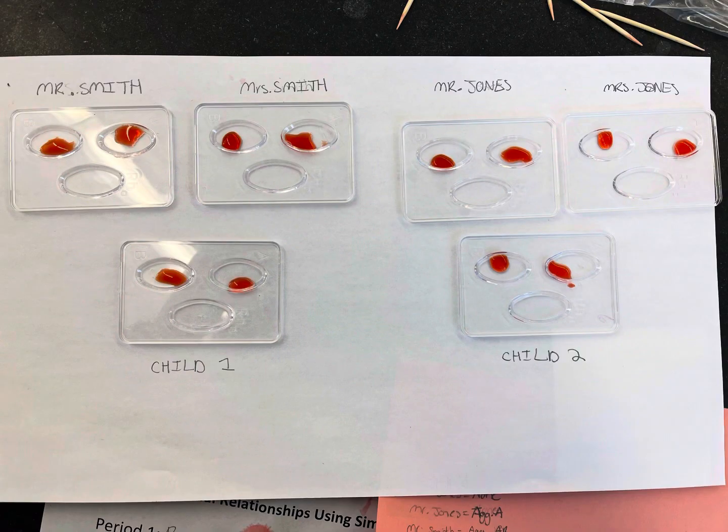Our results indicated for child 1 that agglutination appeared in B. This made it clear that child 1 belonged to Mr. and Mrs. Smith, as Mr. Smith's blood type came back as AB, meaning Mr. Smith was able to pass down that B to his child. If Mr. Smith had blood type A, then this would not be a match, as Mrs. Smith also had blood type A.